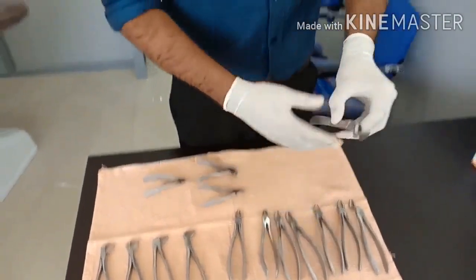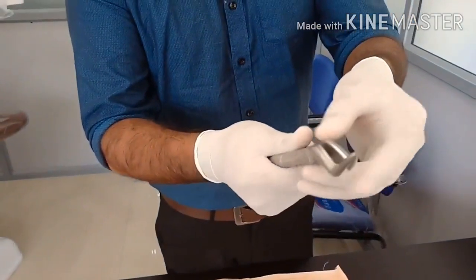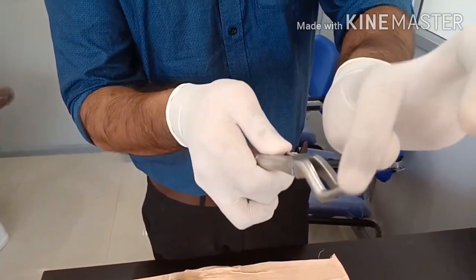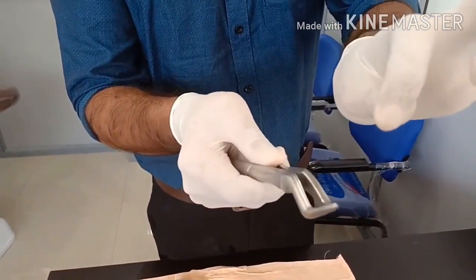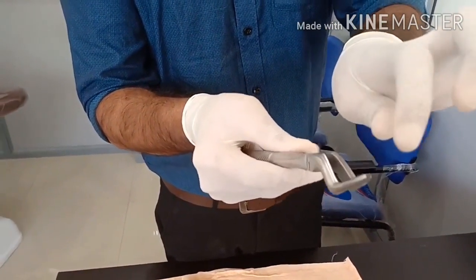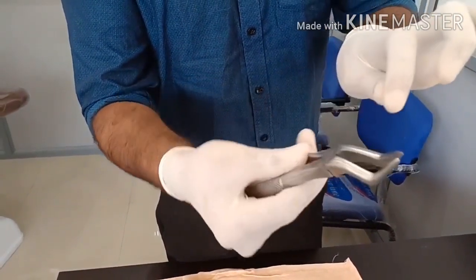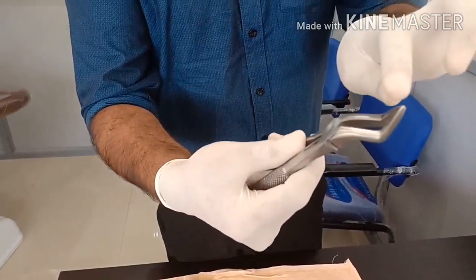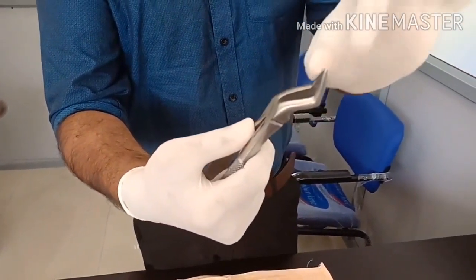There is one more forceps — the root forceps. You can see the beaks are almost touching each other. None of the other forceps have beaks that touch, so if the beaks are touching it is always a root forceps, used to remove root tips. This is an upper root forceps.